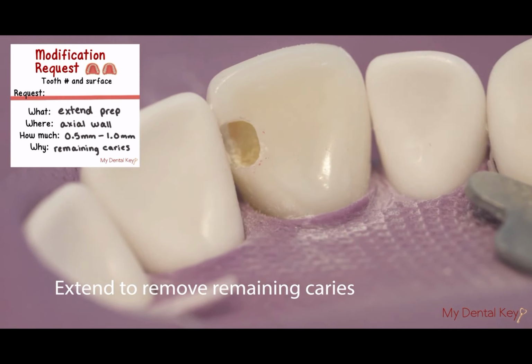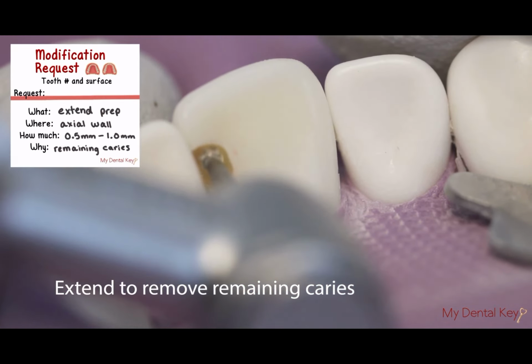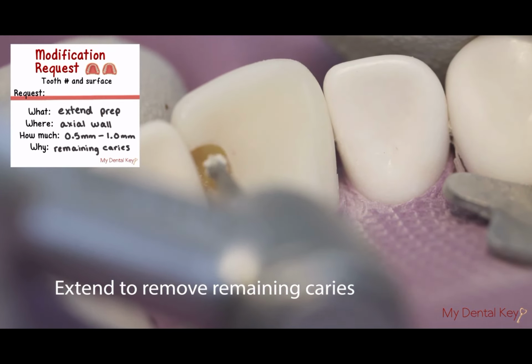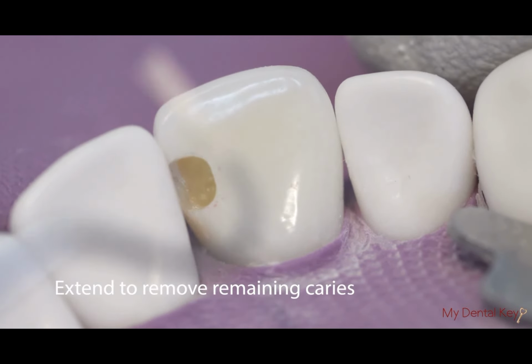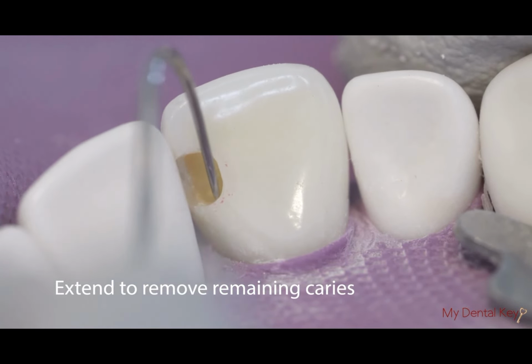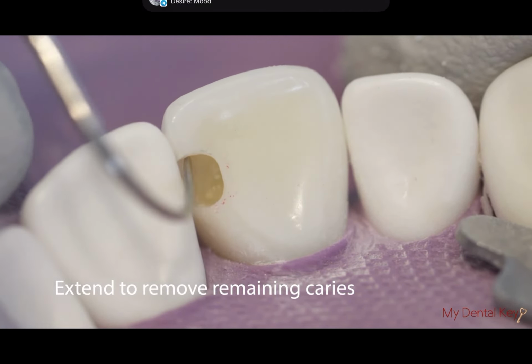Please refer to the candidate manual to see what you should submit with a modification request, such as what you are requesting, where you're requesting it, how much you're requesting, and why you are requesting the modification. On this tooth that we're demonstrating, all of the caries were within the ideal dimensions of the tooth preparation, but this is not always the case.